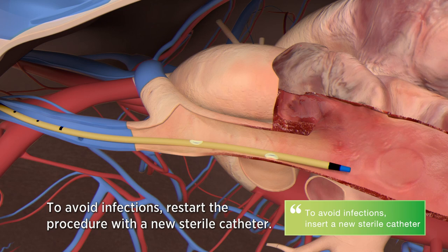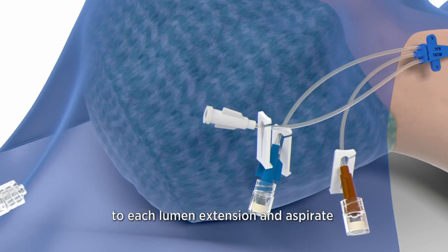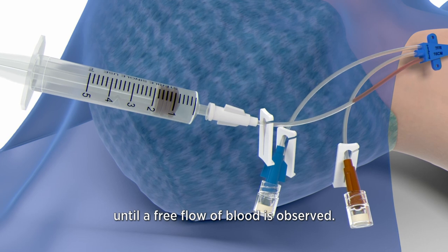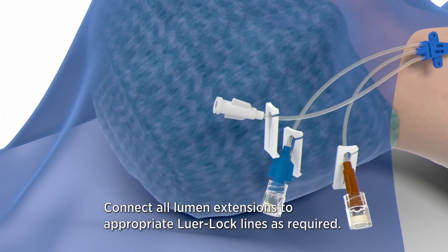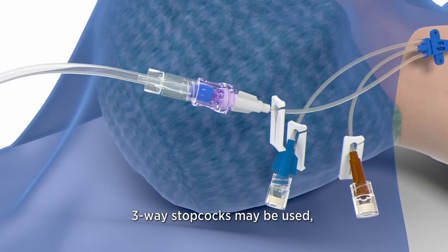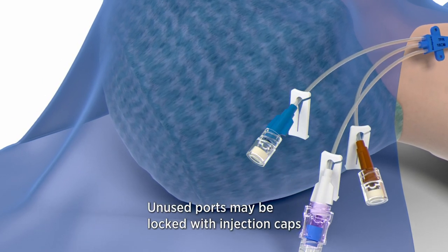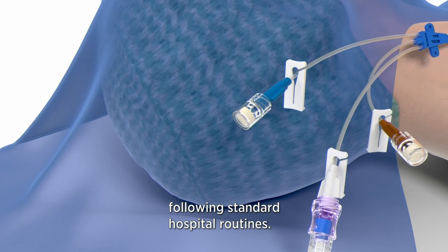To avoid infections, restart the procedure with a new sterile catheter. Check lumen placement by attaching a syringe to each lumen extension and aspirate until a free flow of blood is observed. Connect all lumen extensions to appropriate luer lock lines as required. Three-way stopcocks may be used but are not included in the BIP CVC kit. Unused ports may be locked with injection caps following standard hospital routines.